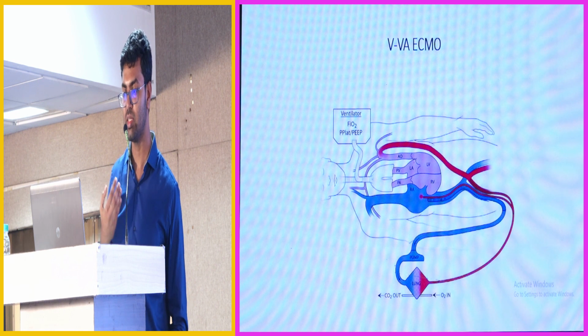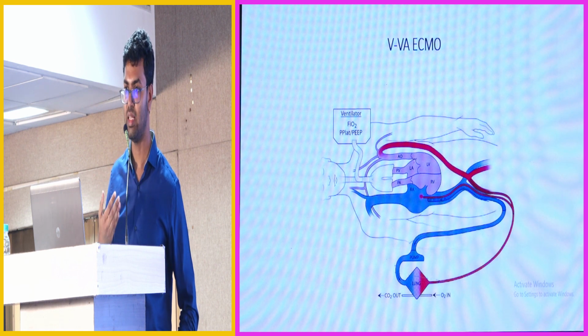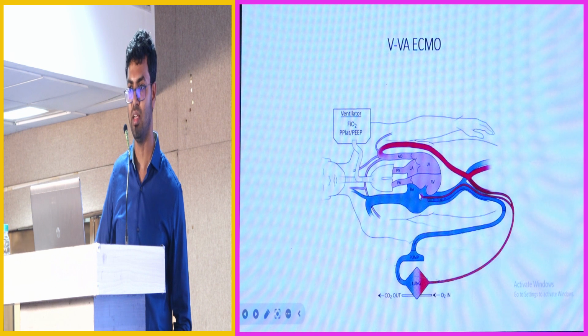Whenever you suspect that the lungs are bad in these patients, you have to take a Y junction from the returning cannula and put it back in the RA. Either you can go from the jugular side if it is difficult for you, or you can go from the same venous side or the opposite venous side. You can give a little bit of oxygenated blood into the RA.